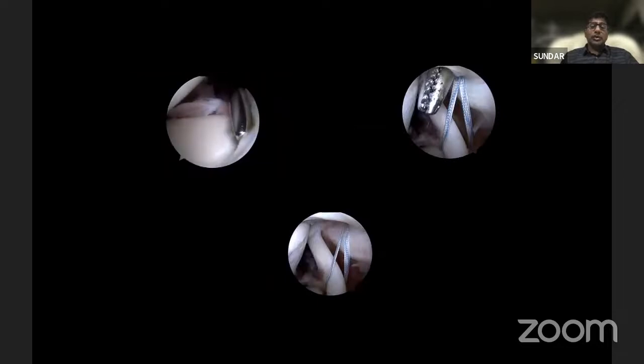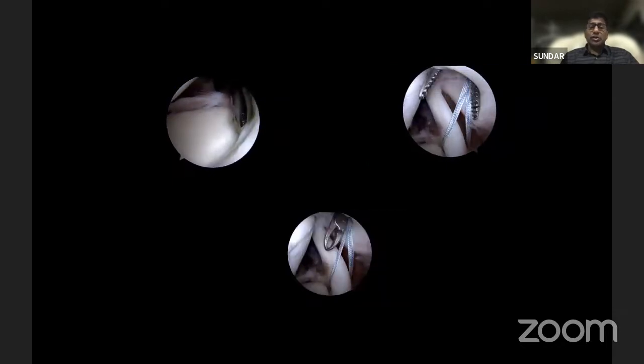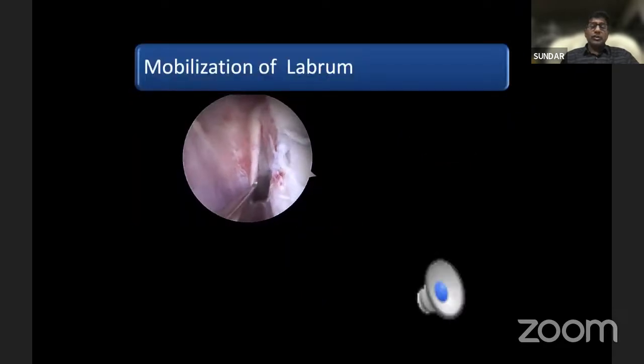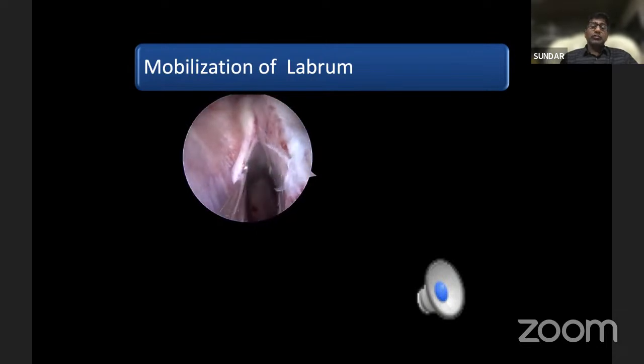So you just prepare the glenoid. Here we are inserting a suture tape, and I prefer to do a knotless anchor so that your job is easier and quicker. And this is how you do the SLAP repair. Once you finish your SLAP repair, you come here. Again, you can see I changed my scope to the anterosuperior portal, viewing through the superior portal, working through the anteroinferior portal.